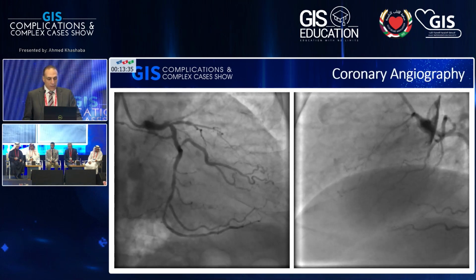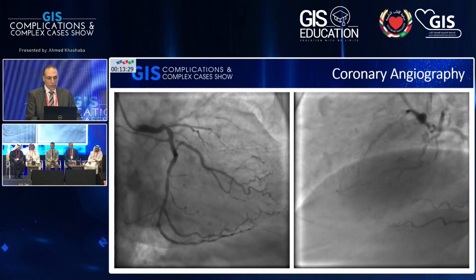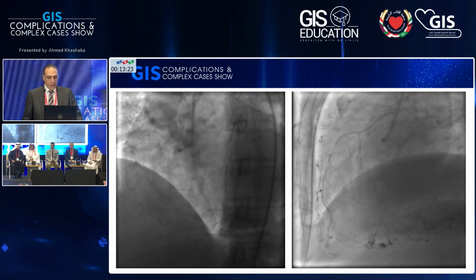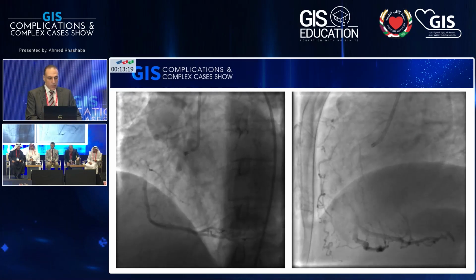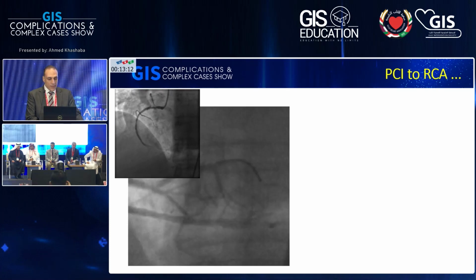This here was her left coronary angiogram, total occlusion of the LAD at origin with no viability. Otherwise, the left system showed mild irregularities, no significant disease. RCA had a long calcified lesion in the proximal part that was fixed. And I reviewed the film when I was there in the initial part. During the PCI, you can appreciate the wire is nicely folded in the distal RCA.